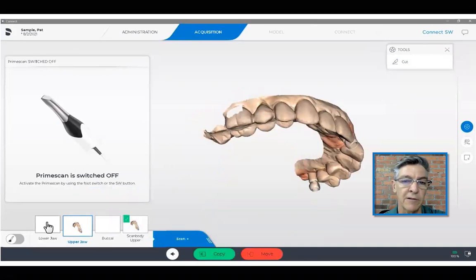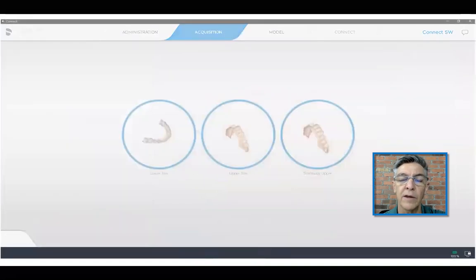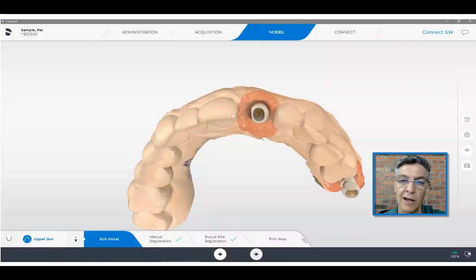When that is completed, I just simply have to scan the opposing arch, scan the bite, and move forward into the model stage. Once the model is created, I will usually look it over and evaluate where that access hole is going to be relative to the rest of the teeth, because that may affect my decision on design later on.